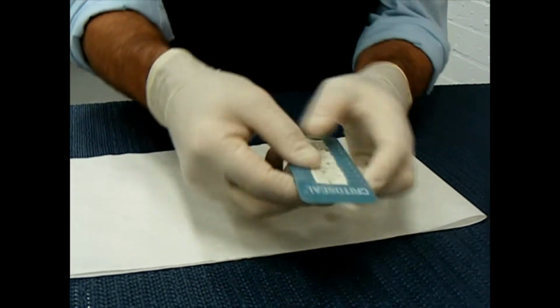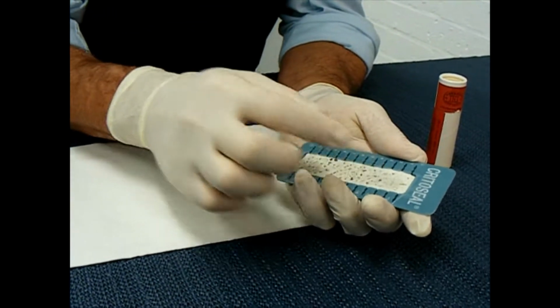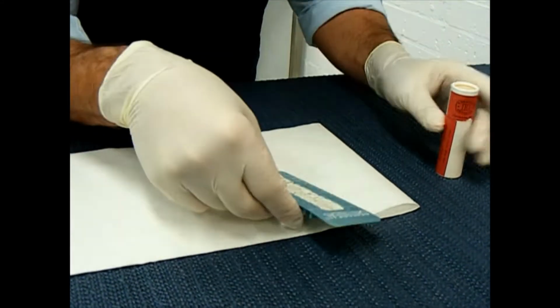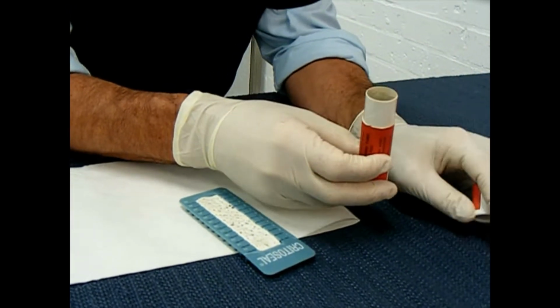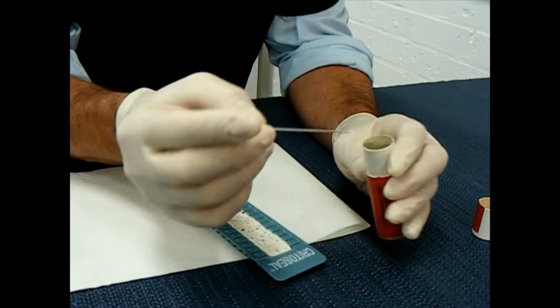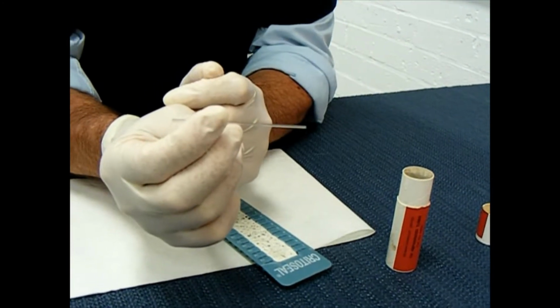This is some plasticine here. There's different products like this. It's designed to plug the end of the capillary tube, which I'll show you. These are the capillary tubes. They're called capillary tubes because a capillary is a very thin, hollow tube, and liquid can flow uphill against gravity up a thin tube like that.